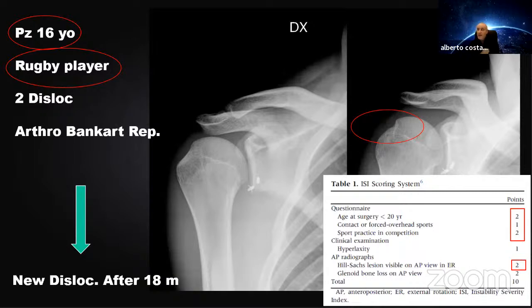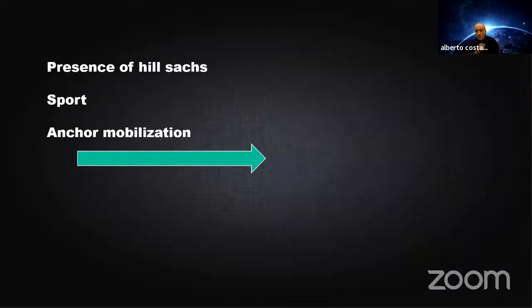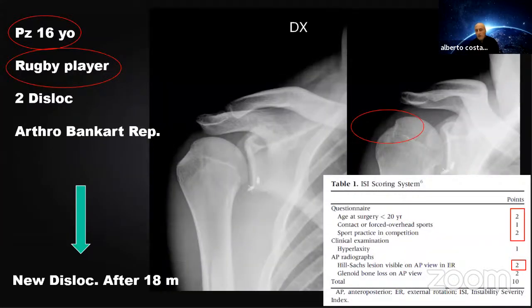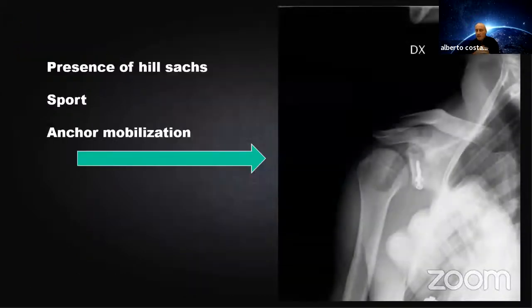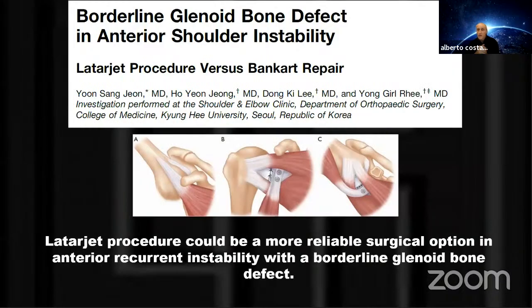These values are 7, and according to the ISIS score, it should not be done arthroscopically, but in an open way. So what I did, after the second operation, was remove the mobilized anchor. Did you see down there in the axilla? I removed the anchor and did a Latarjet procedure. This is important because if we leave it alone, we may have more and more bony defect that becomes harder and harder to treat. Also, there are people who talk about borderline glenoid bone defect, in which they put arthroscopic Bankart in relation against the Latarjet procedure.